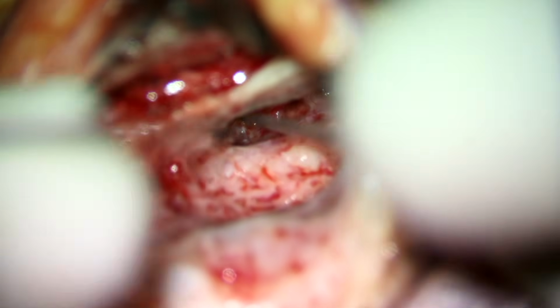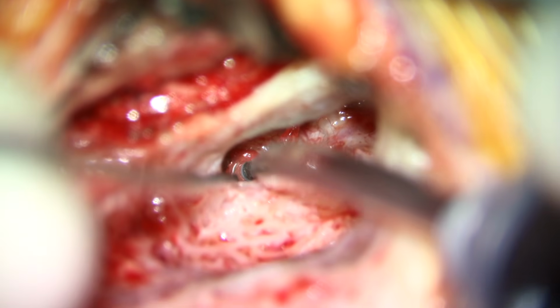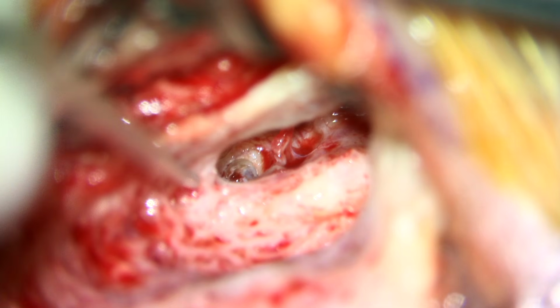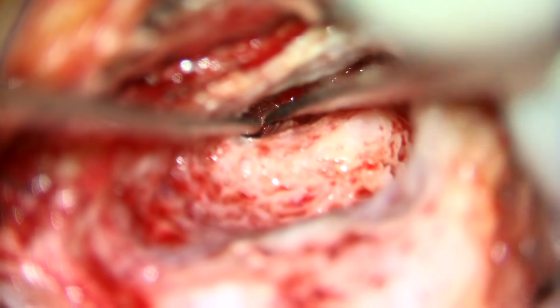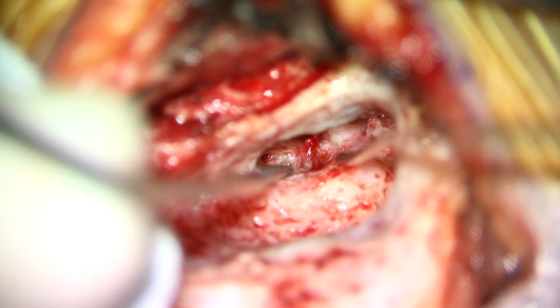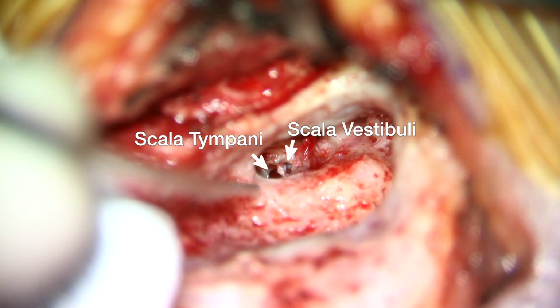Here's an example of a partially ossified cochlea without any residual hearing. The round window was obstructed by pseudomembrane, but clearing the fibrous tissue demonstrated a true round window membrane. The visibility was poor, so the posterior superior overhang was drilled, followed by the anterior inferior wall, creating an extended round window along the basal turn. While that was a large enough opening, the electrode still wouldn't thread up the pars ascendens due to fibrosis in the scala tympani. So we intentionally opened the scala vestibuli by drilling antero-superiorly. You can see us manipulating the basilar membrane to open the scala vestibuli widely. The electrode thankfully passed easily through the scala vestibuli.